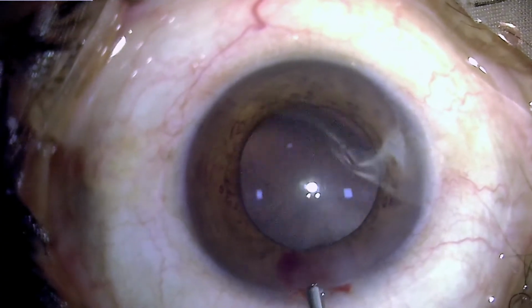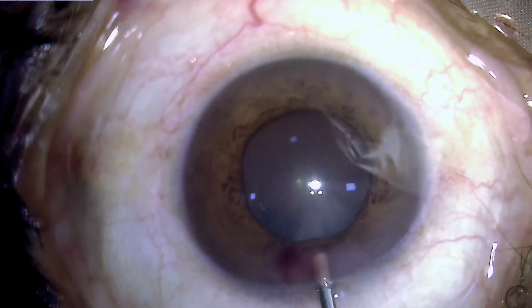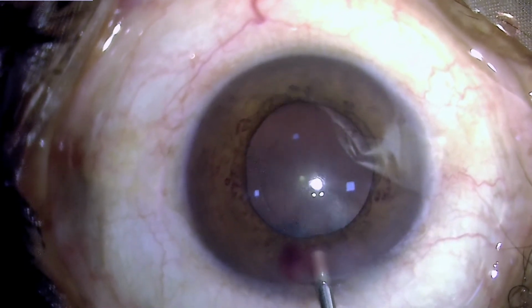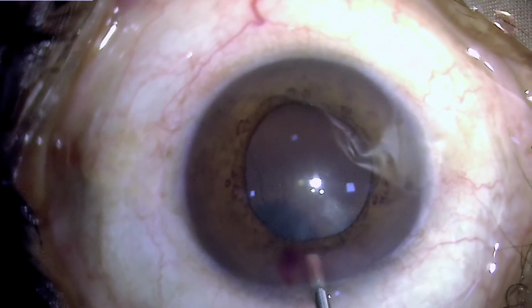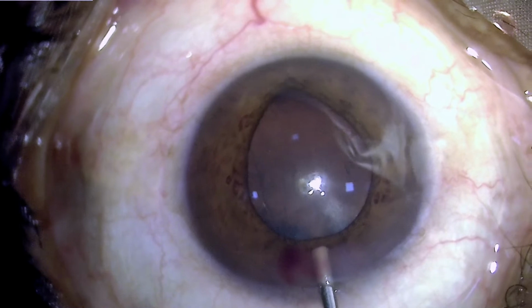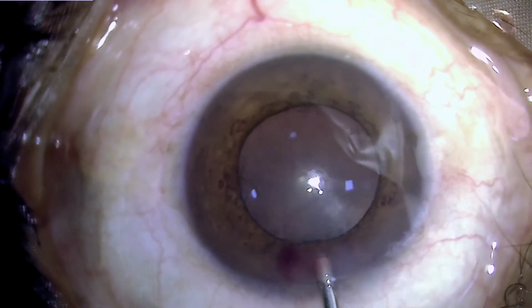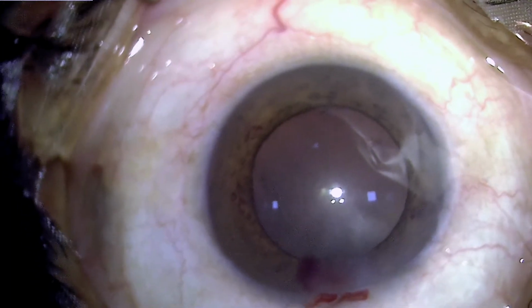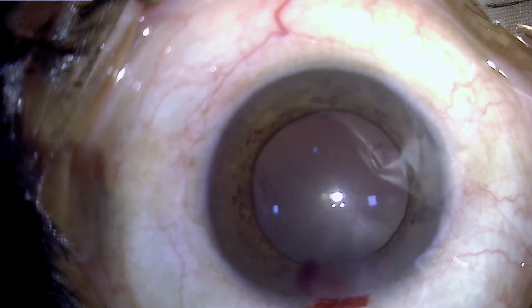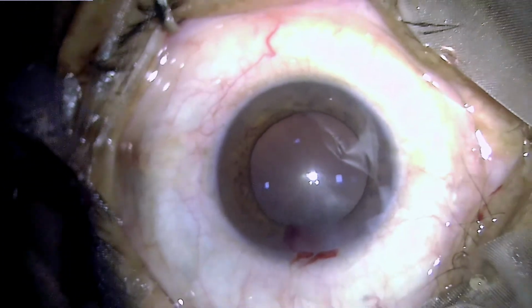Once this clot has been removed, we are injecting BSS to form the anterior chamber and also to flush out any remaining blood which may be trapped behind the iris. It's mandatory that a good amount of flushing is done so that none of the bleed or clot is retained inside. Once you inflate the anterior chamber, the pupil dilates further and the case has been finished. Pressure is well maintained, the wound is sealed.